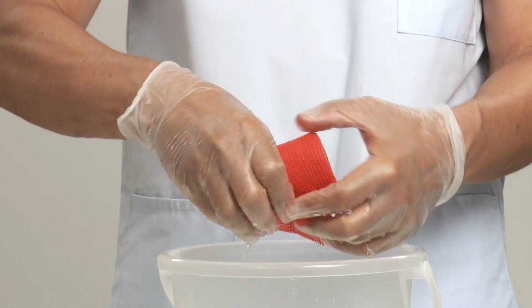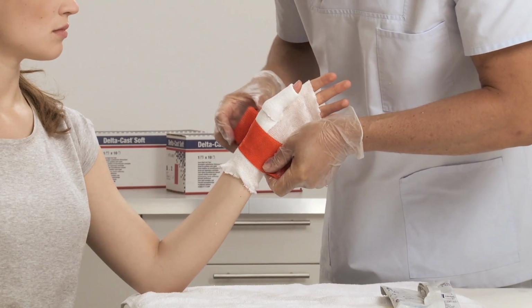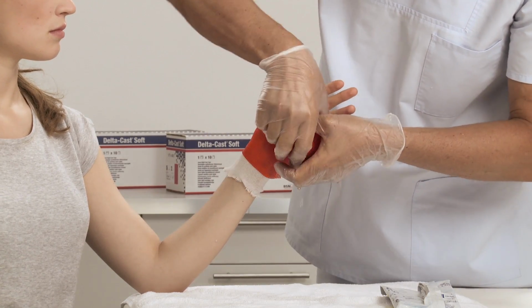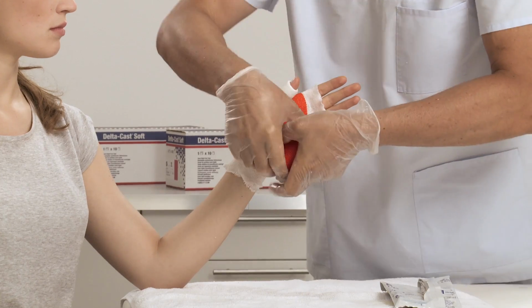Activate Delta-Cast Soft by squeezing it once within and once gently out of the water. Start applying the synthetic cast tape at the wrist and then wrap around the thumb. Ensure a 50% overlap and smooth down.